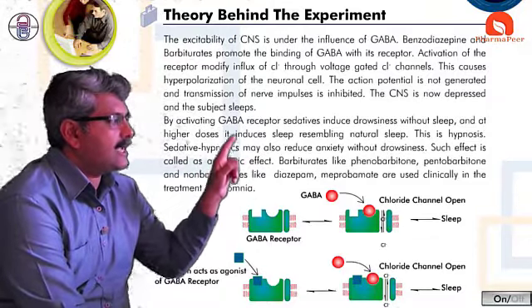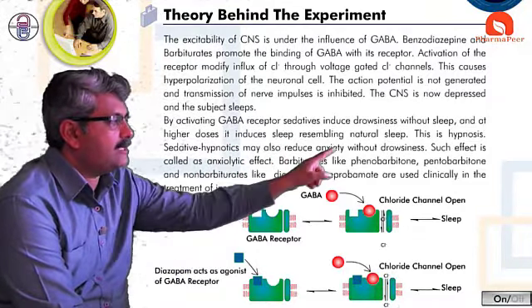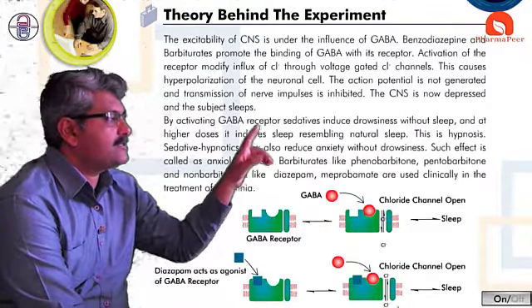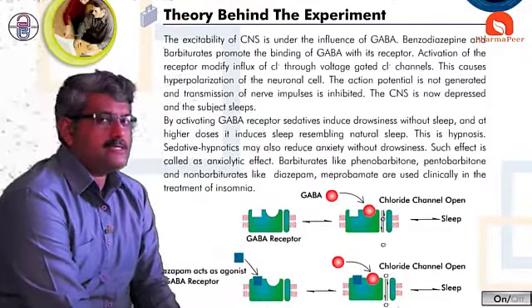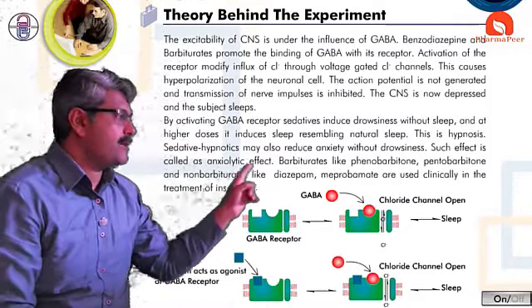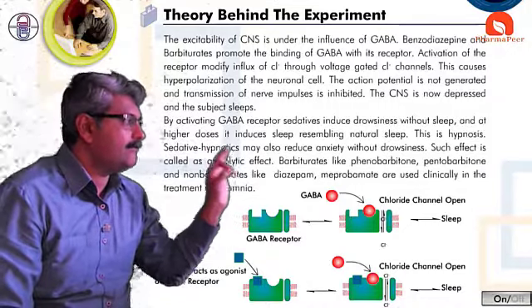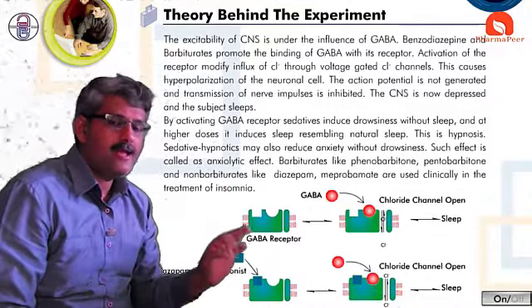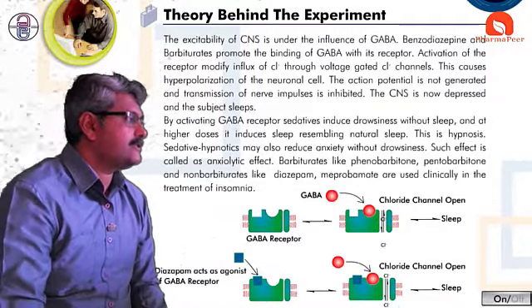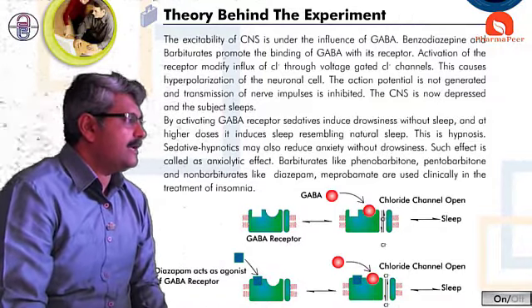Hypnosis means inducing a natural sleep, and getting drowsiness is nothing but sedation. Sedative hypnotics may also reduce anxiety without drowsiness, and such drugs are called anxiolytics.